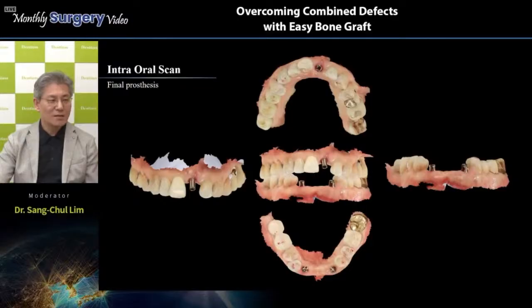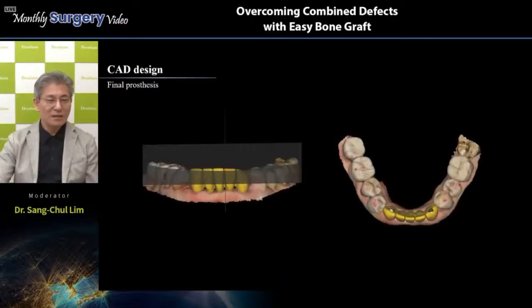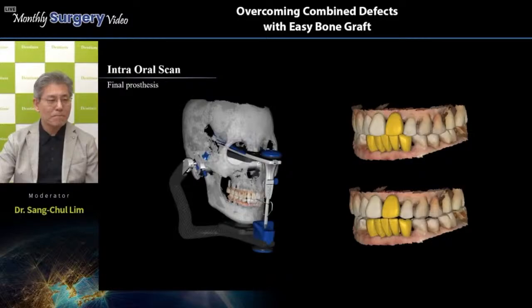Okay, and scanning again, an intraoral scan for the final prosthesis, as you can see. All of these scanner images are sent to CAD, and the CAD design for the final prosthesis looks like this. So we're going to make this final restoration using the articulator.